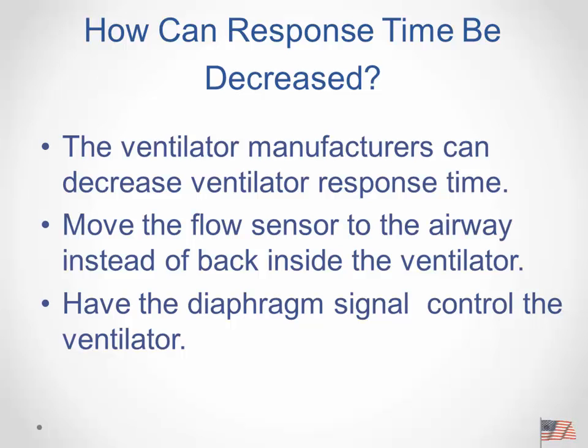Well, ventilator manufacturers are pretty much maxed out on what they could end up doing as far as having a faster response time. It's just something inherent within the design of any ventilator. The ventilator is looking to see a certain drop in pressure. Unless we make that sensitivity so sensitive that it's going to pick it up earlier, but then you run the risk of auto-triggering. So it's a double-edged sword.